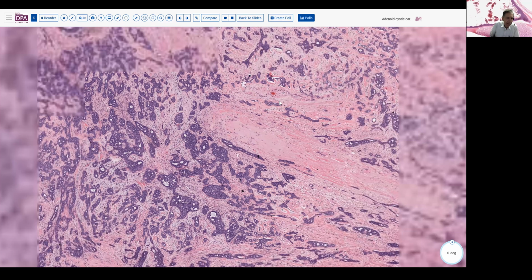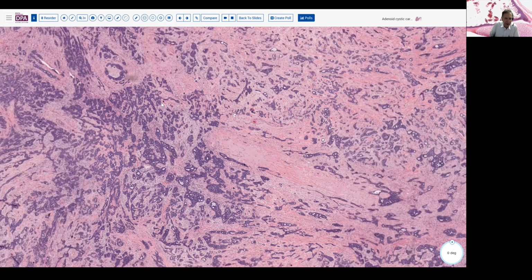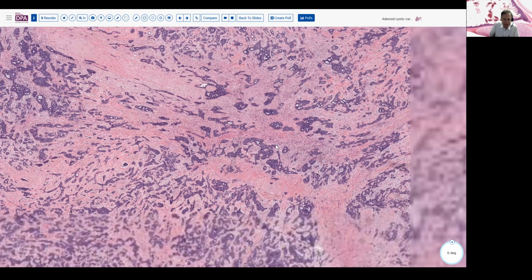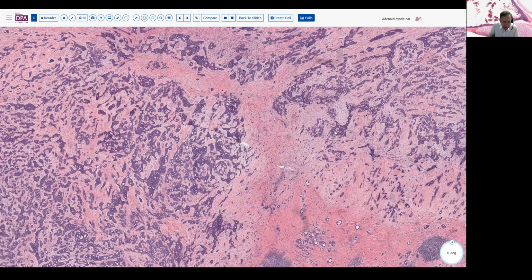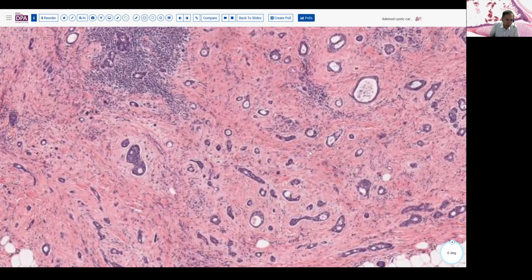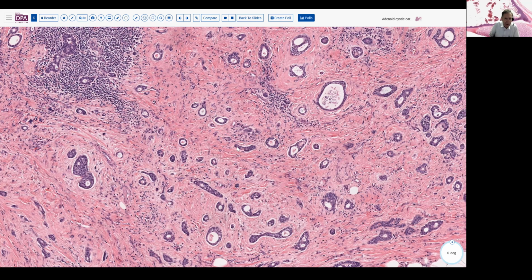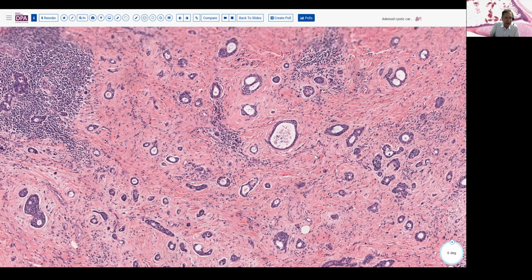This is a lesion that is somewhat reminiscent of adenoid cystic carcinomas that, as we've indicated, occur usually in the salivary glands and so forth. They can occur, however, in the vulva, where whether they arise from the mammary or apocrine tissues is not clear, but they occur here as they do in other locations.